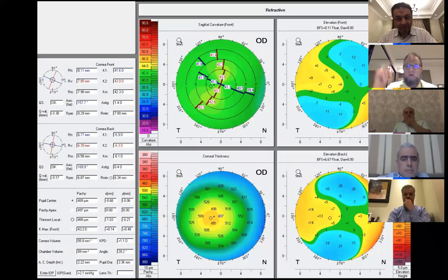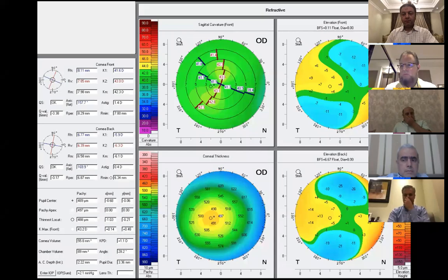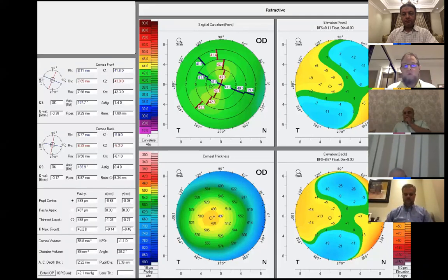This is one point. The other point: this group of colleagues say, why treat the full amount of the +6? Since it is an amblyopic eye, we can treat +5, for example, and in this case, we will not end up with more than 49 Km. Correct? So they will fully correct the left eye, and for the right eye, undercorrect, since it is already amblyopic. So what do you say? I want to hear your opinion about this point.